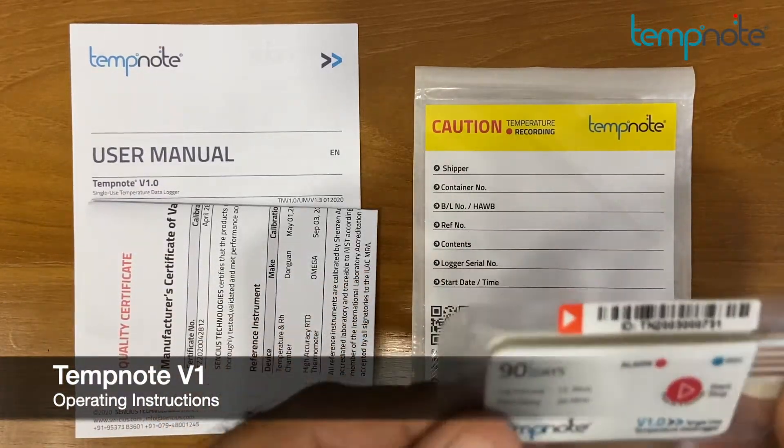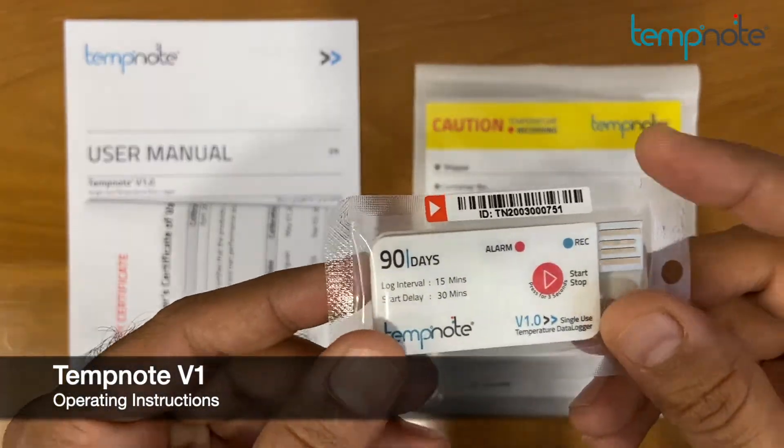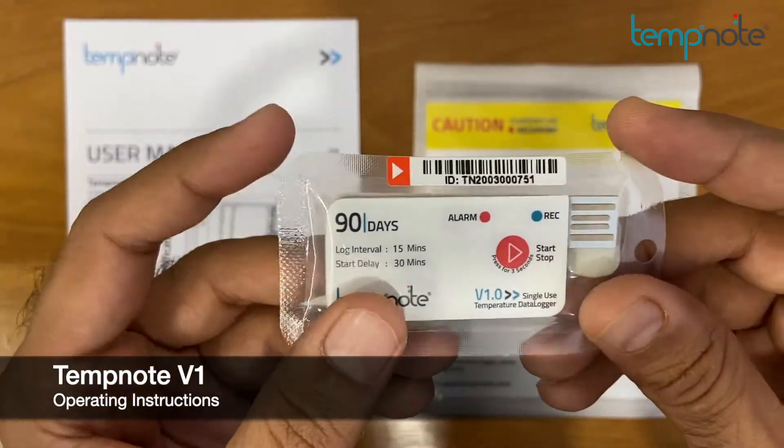In this video, we will show you what comes with TempNote V1, single-use temperature data logger, and how to operate TempNote V1.